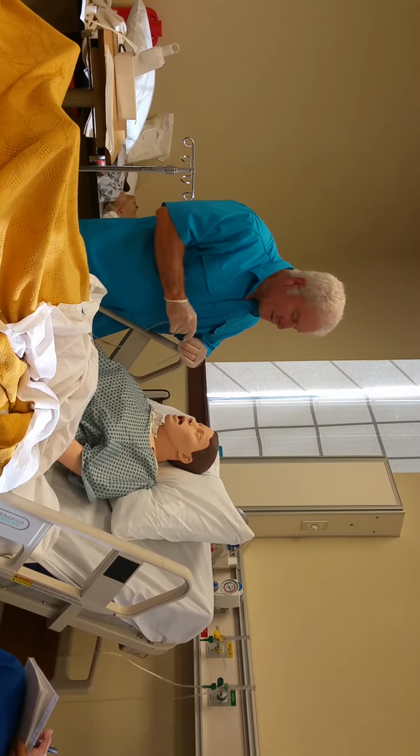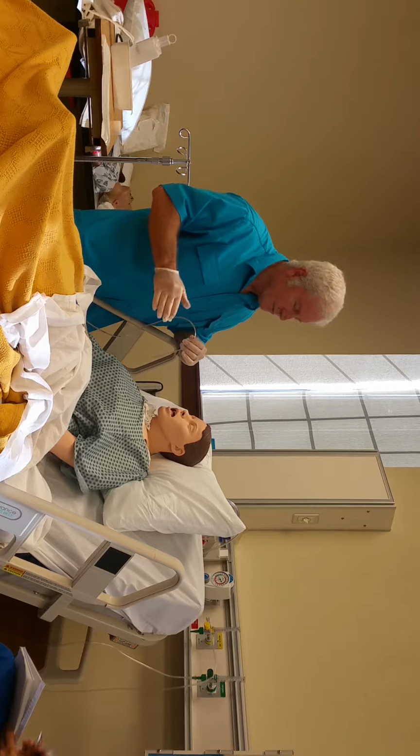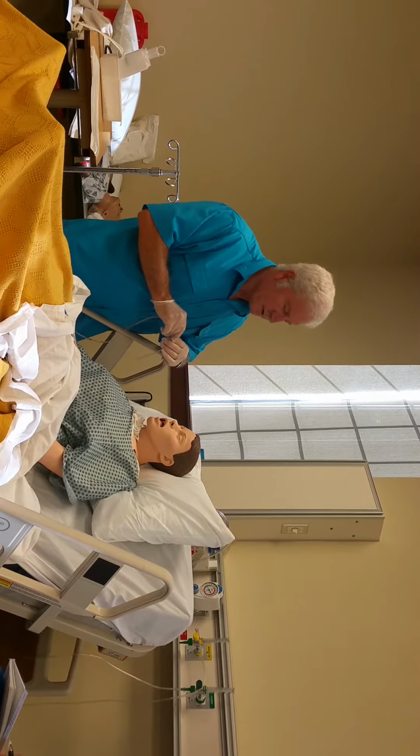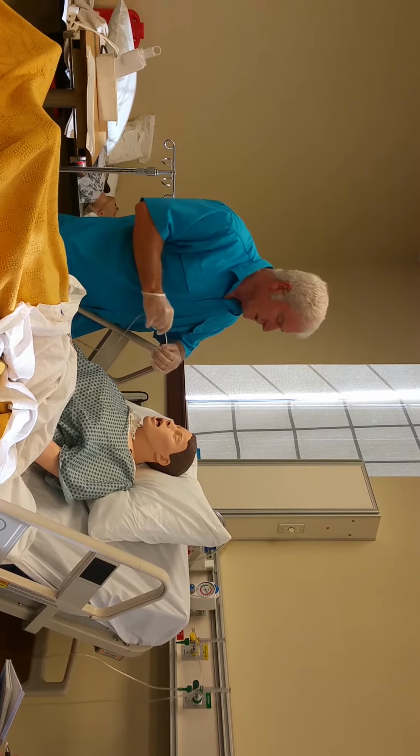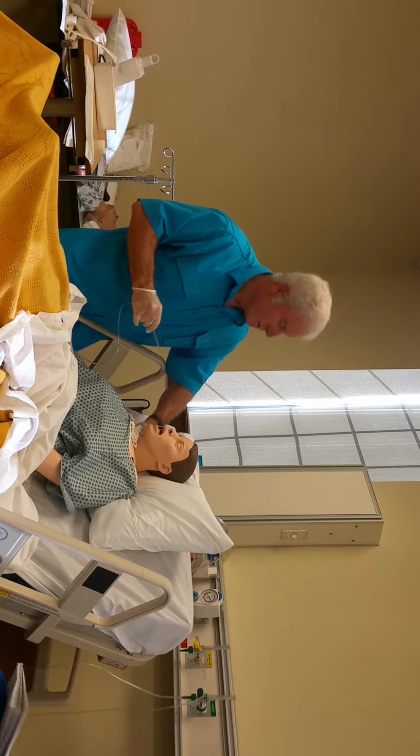It's gonna hit your gag reflex. It's gonna make you wanna gag probably, but just fight through it with me for 30 seconds and we'll get this done. That's what I tell them all, okay? Just be honest with him. He knows, that way he knows what to expect, all right?